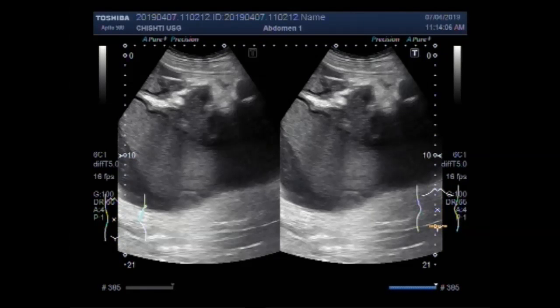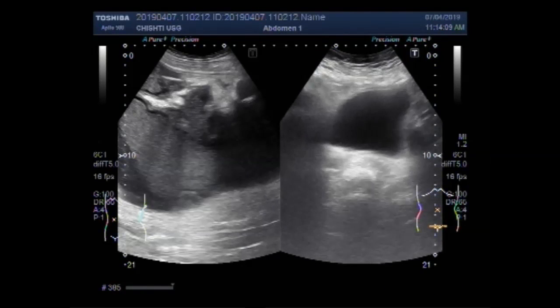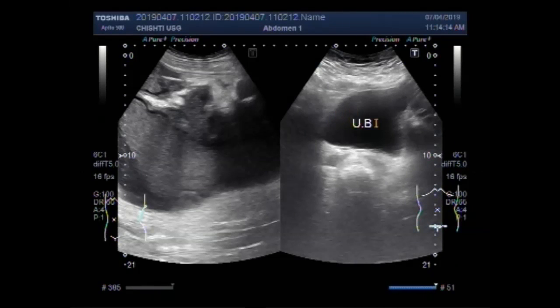Now you are going to see the urinary bladder. This is the urinary bladder.